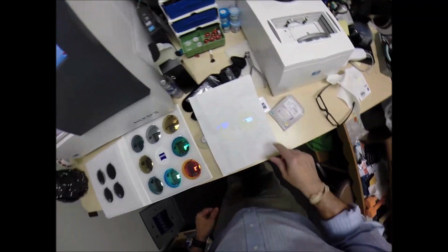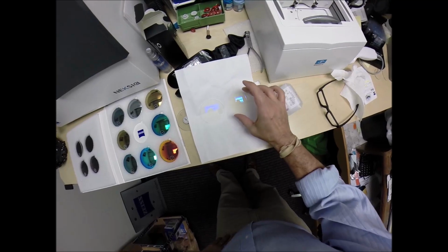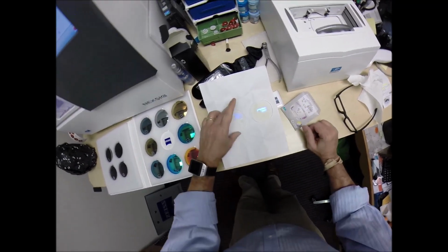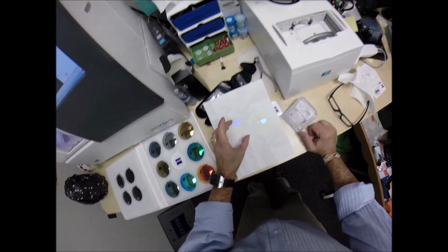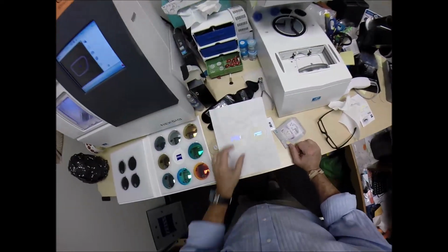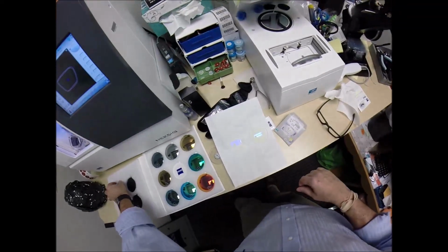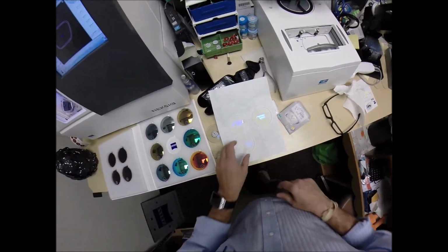but when you hold it over a piece of paper, the Crizal Prevencia is a darker color. It's a yellowish brown. This is much clearer of a lens. So you get the blue protection with the clearest possible lens color. Much more brown than that one. The DuraVision Platinum. You see that one there.